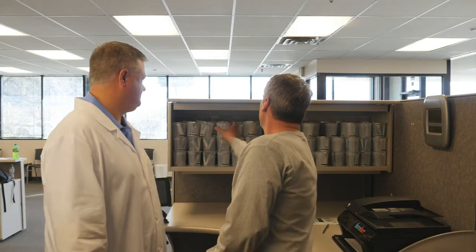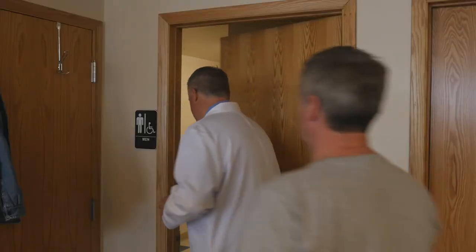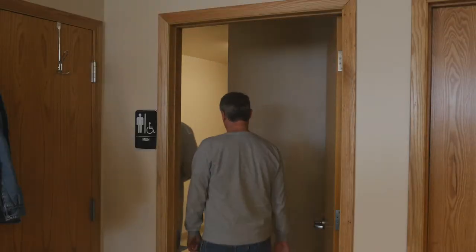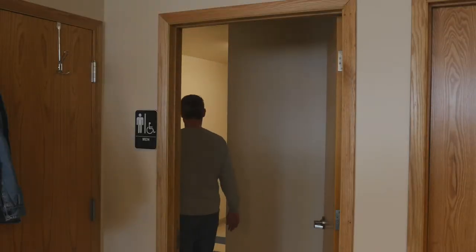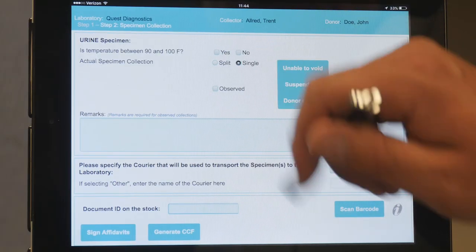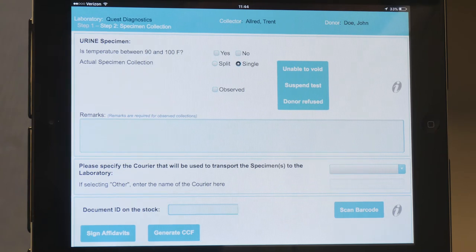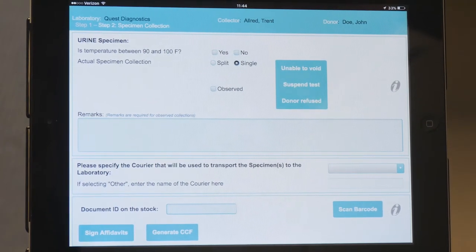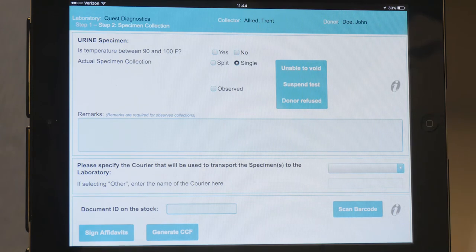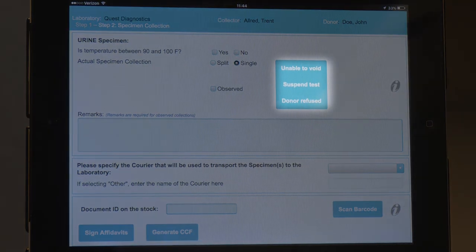The donor should select the specimen cup to be used and then enter the restroom to void. On the next screen, you can record vital information about the test. If the donor is unable to void into the cup or insufficient volume is provided, the collector should suspend the test by tapping the button entitled Unable to Void, Suspend Test, or Donor Refused.